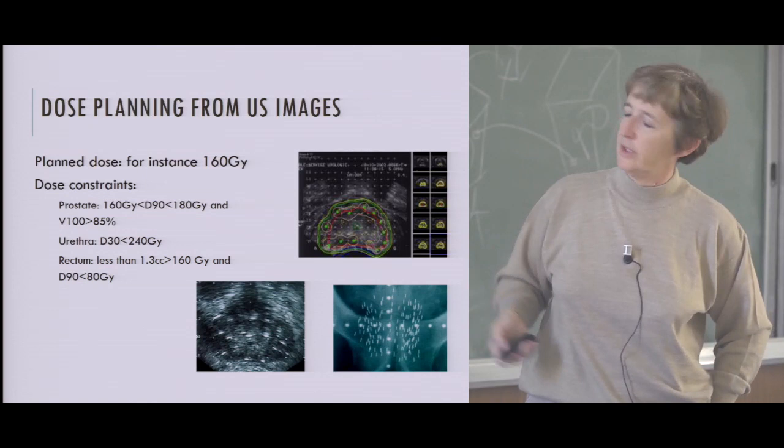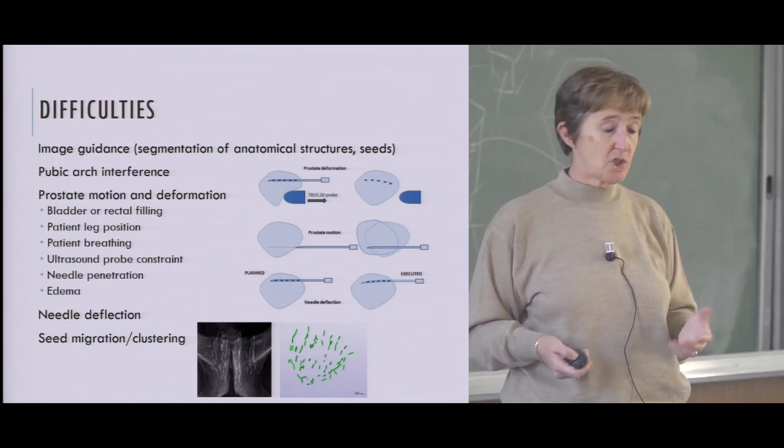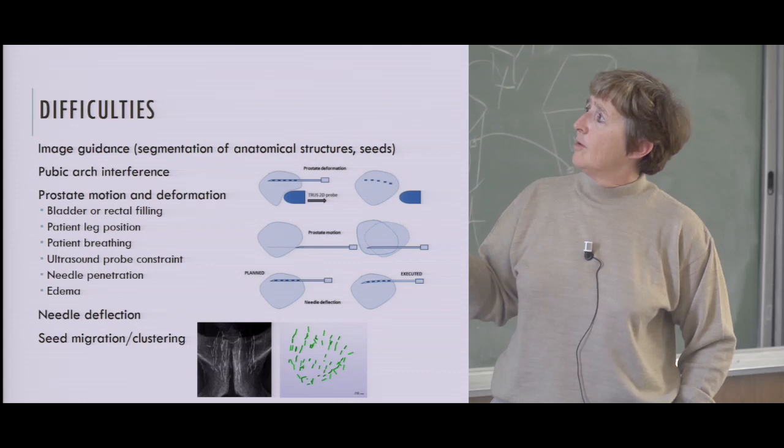And that's a little bit difficult to do, for many reasons. Some of them are related to the fact that the ultrasound images you have seen are not very easy to manage. But you can also have collision of needles with the bone that you cannot see in the US image. And you have plenty of inaccuracy that comes, for instance, from the edema.